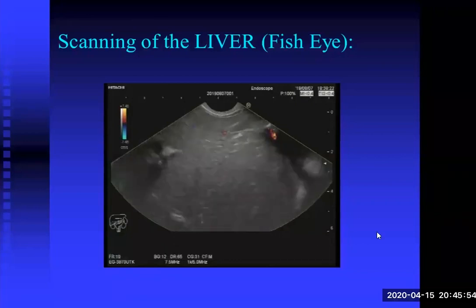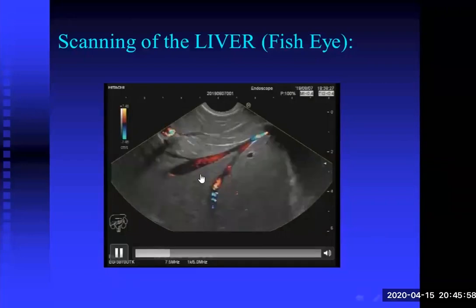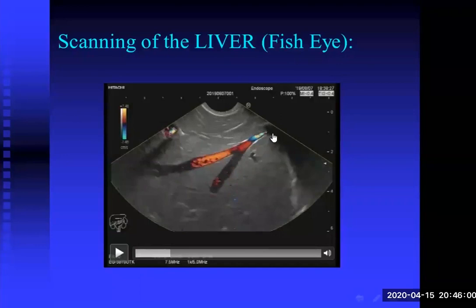Yes, I am now doing anti-clockwise rotation. Very nicely seen, this is the middle hepatic vein, a very long vein with homogeneous diameter over its whole length. And this is the left portal vein. And here, this is the ligamentum venosum communicating the left portal vein to the inferior vena cava. So these segments are caudate lobe 1, 4A, and 8.